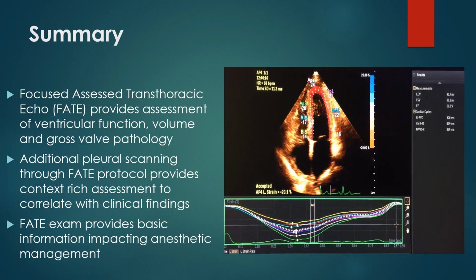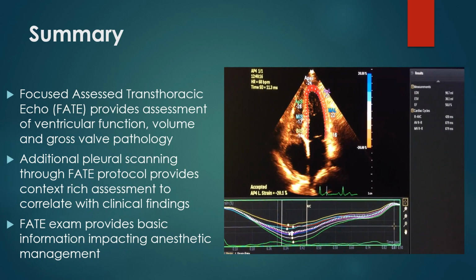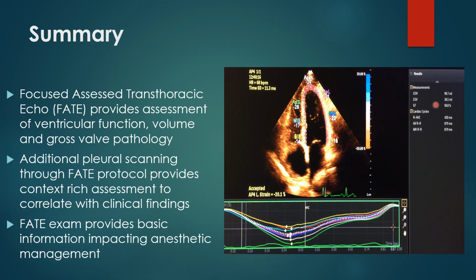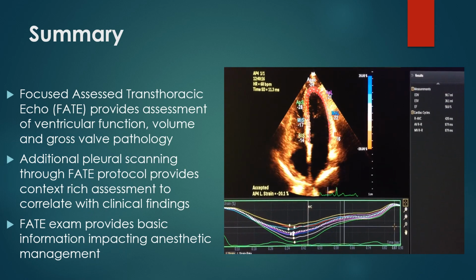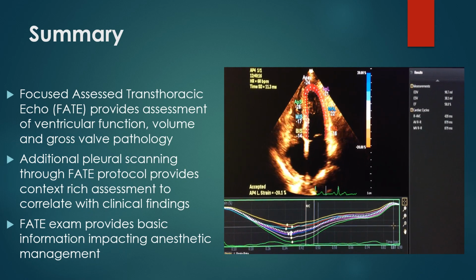This is actually a 3D echo I did on myself about 4 or 5 years ago, and I showed it to my students, and they all looked at it and saw the EF was 58%, and they said, "Oh, dude, your EF's down." So anyway, thank you very much for experiencing this presentation.